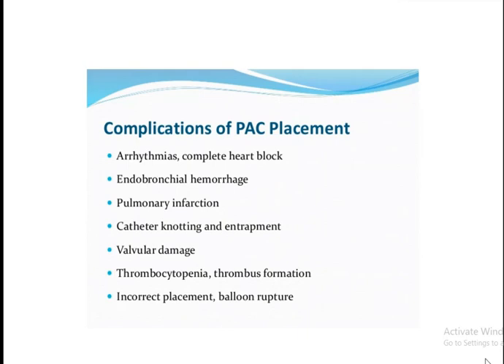Then bleeding can occur, pulmonary infarction can occur. The catheter can get entrapped in the ventricle, it can coil, or it can knot in the pulmonary arteries. Then there can be valvular damage, thrombus formation, incorrect placement, or balloon rupture. So these are the various complications.